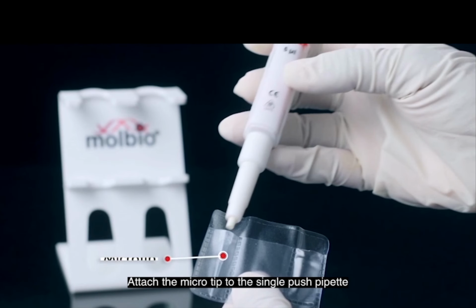Here you have to use this 6 microliter pipette. It is only one volume, so you don't have to adjust the volume and all. When you attach this tip also, you have to be very careful. If you just put the pipette on the tip and press it against the plastic envelope, what will happen? The sharp front end of the tip will get bent.